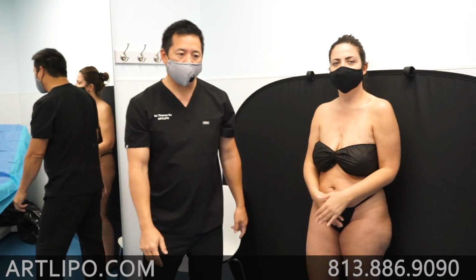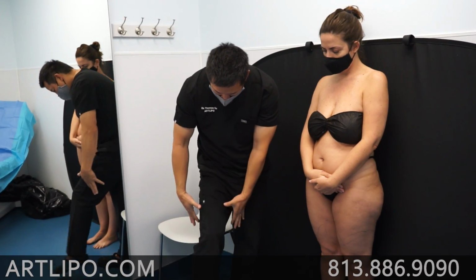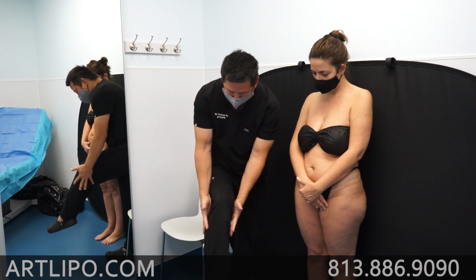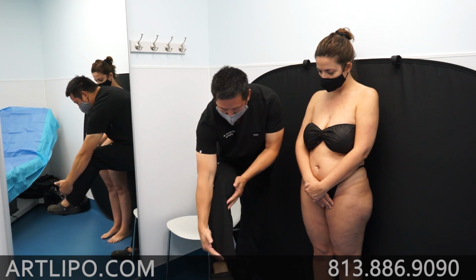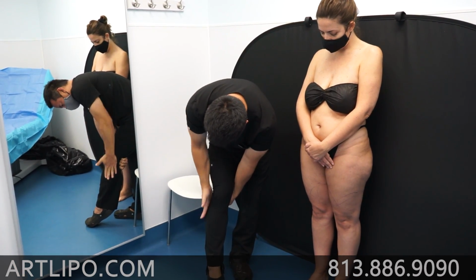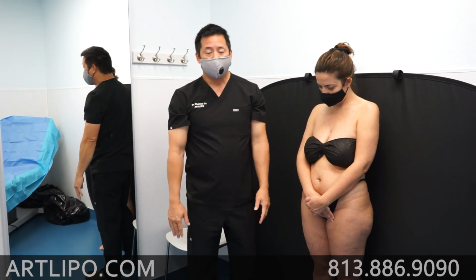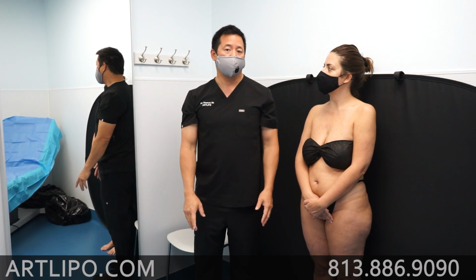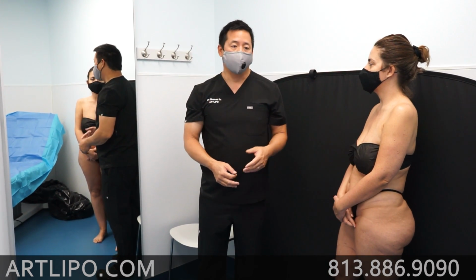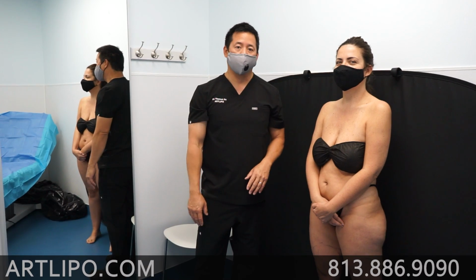Okay. So in any case, we will start with what I call the cankles and the knee complex, which is starting down here and coming all the way up about mid-thigh. I call it the knee complex because when we're doing the knee, it's not just a little area right here. We're doing a circumferential treatment around the entire knee, this being the cankle area, this being the knee complex. And what we're achieving is that we're trying to get a thinned out area that shows curve and the full slimness around the knee, making it the narrow point. This is something that I would say very few doctors have ever done. It's more apt to describe that as a circumferential or a lipo 360 of the knee. So that's going to make a really big difference in the shape of Mary's legs. Okay, so we'll come back and show you the results a little bit later after we finish, okay? Thank you.